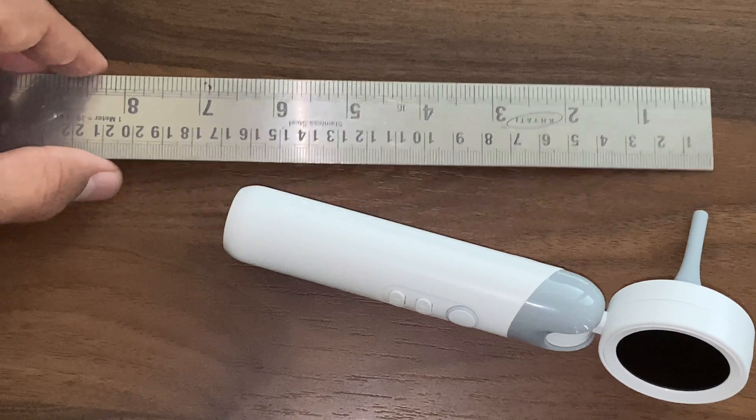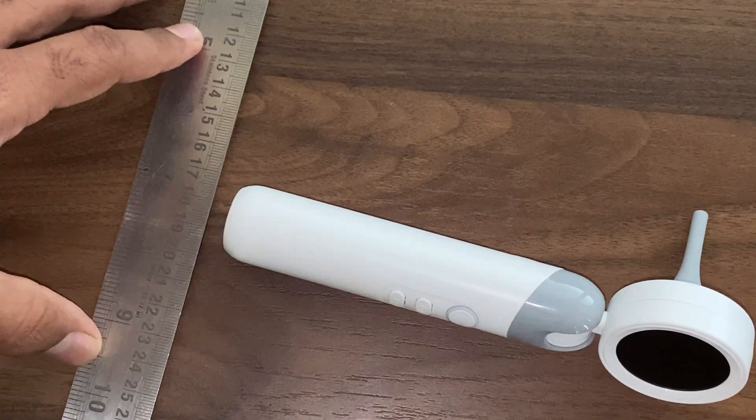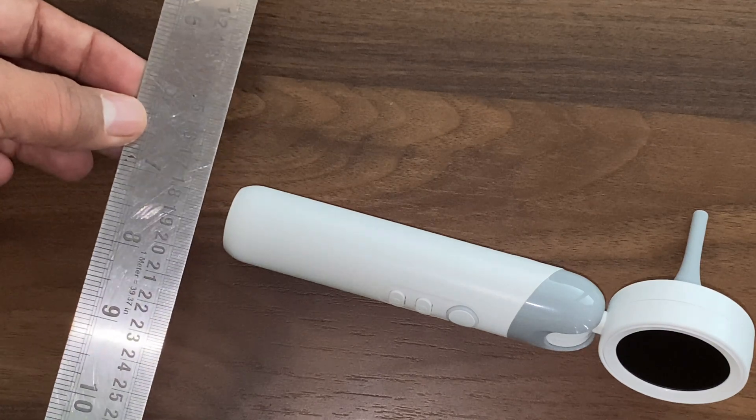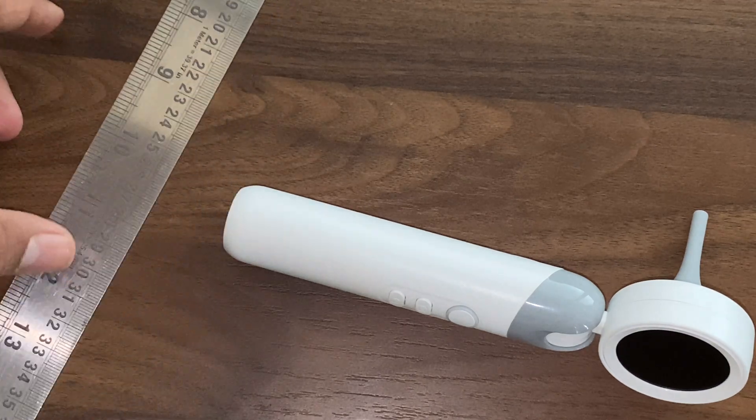I personally feel this is a very good instrument. If you wanted to buy it, you can check the description box. Thank you.